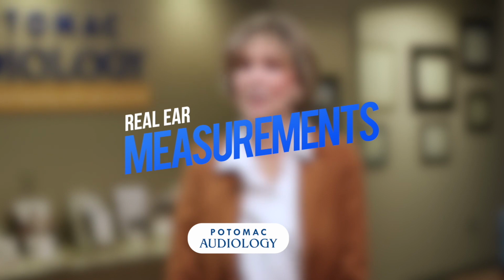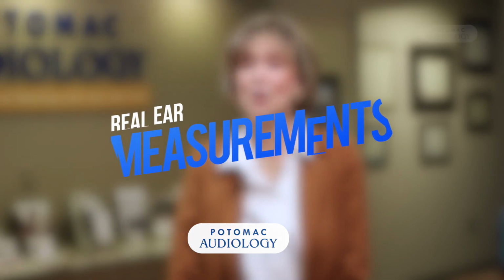Hello, my name is Gail Lynn, and today we're going to do a procedure called real ear measurements. This allows us to measure what a hearing aid is delivering to the ear. If you don't measure what the hearing aid is delivering to the ear, it would be similar to putting on someone else's glasses and wondering why you couldn't see very well.